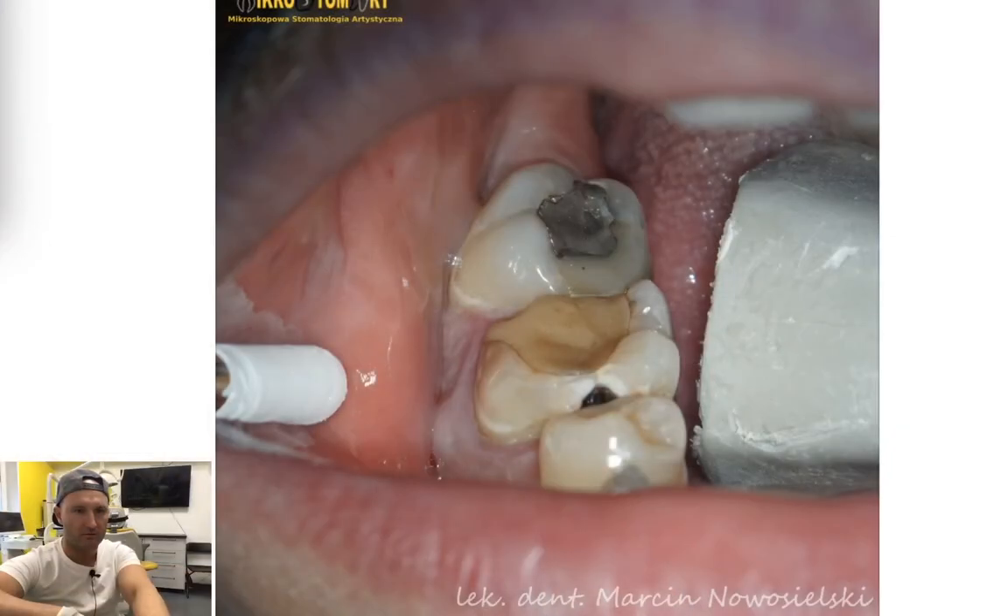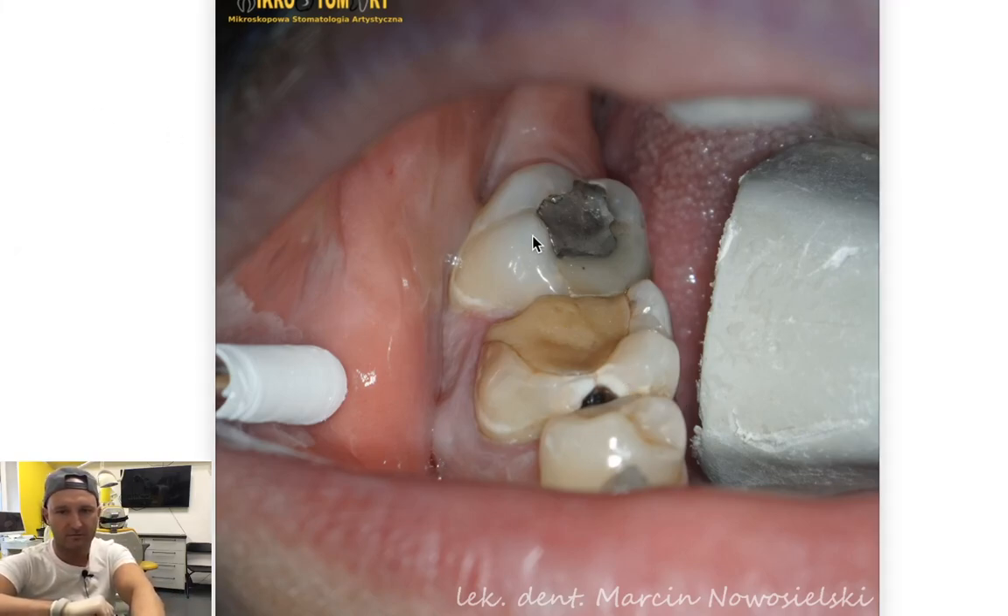Hi guys, Markin here, the dentist, and another episode of Dental MacGyver — tips and tricks for dentists. Today we go with something more difficult: a buildup case that requires buildup before endodontic treatment.